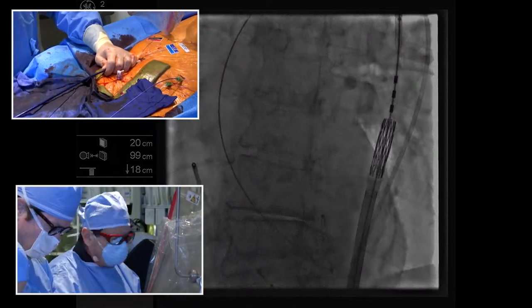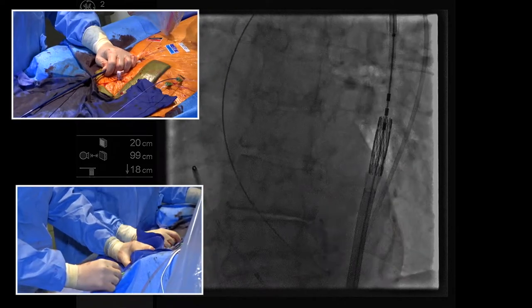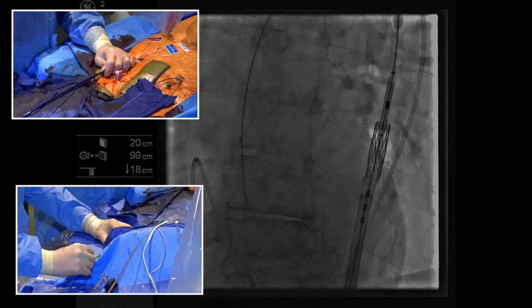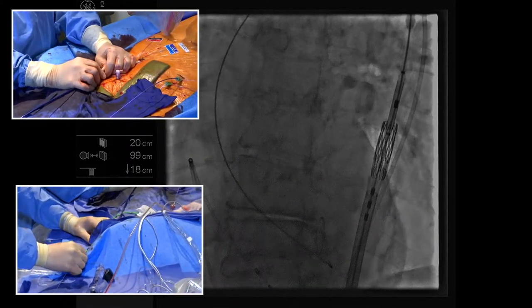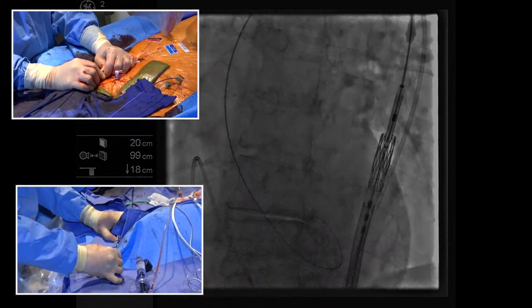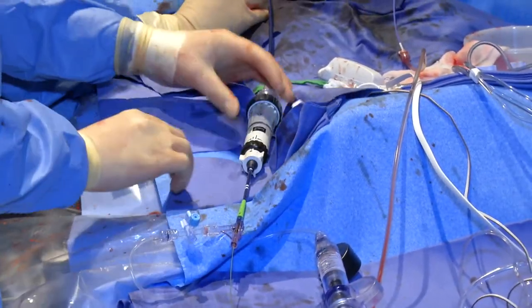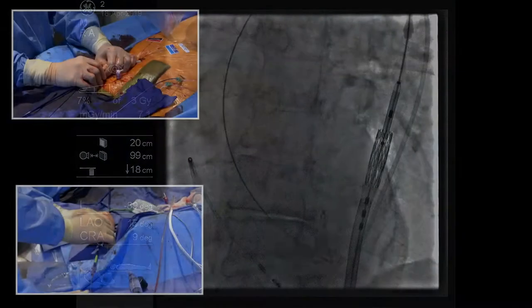Ray's going to open that up, and I'm going to keep my eye on him because he's in training here. He's going to pull the balloon part of this assembly. The wire. Got to have your wire go out first. I thought this was a very ingenious idea to have the wire, the balloon, and the valve separate. So now you can drop that and just, good. Locked? All the way locked? Yes. Okay, good. Now turn backwards on the, yeah, you got wire.